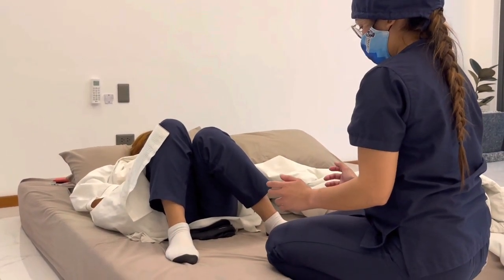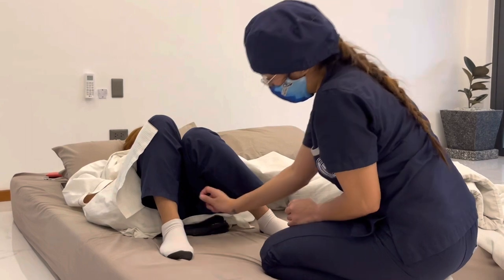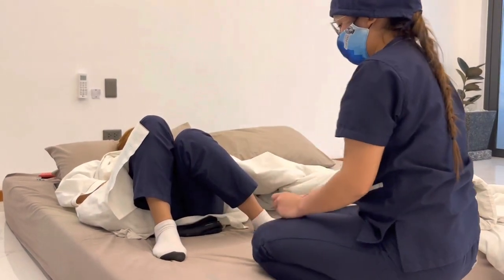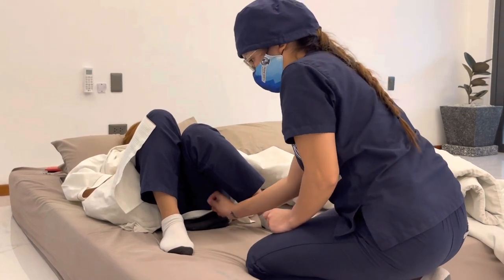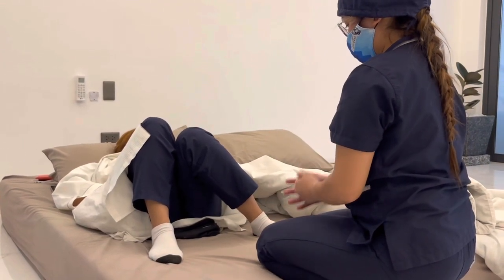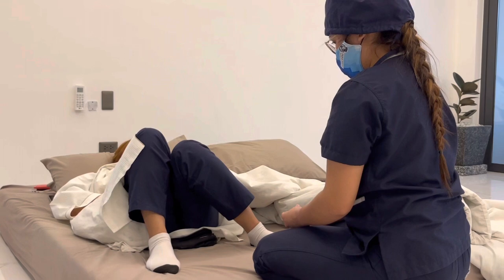Using the sterile hand, pick up an antiseptic solution-saturated cotton ball with sterile forceps. Cleanse the urinary meatus with one downward stroke. Discard. Repeat this 3 times. Use forceps and dry sterile cotton buds to absorb excess antiseptic solution, then assist the patient in voiding. Rationale: absorbing excess antiseptic solution prevents introducing antiseptic into the urethra, which could cause discomfort and mixing with the obtained specimen.